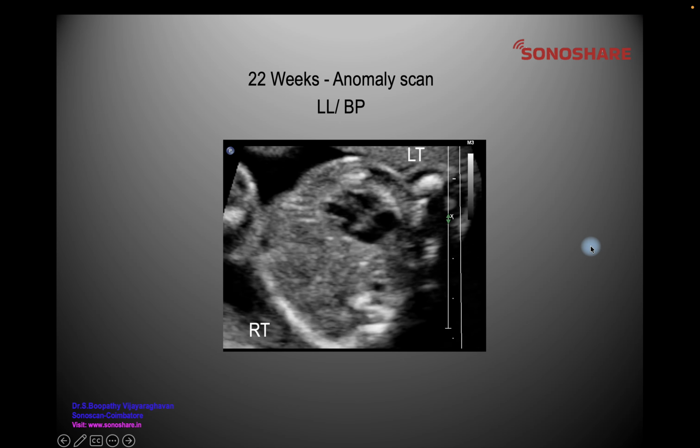This is next in the series of image to diagnosis in fetal medicine, first in the series of fetal thorax. This is a 22-week fetus coming for anomaly scan. Fetus is in longitudinal lie, breech presentation, and this is the axial scan of the chest, the level of the four-chamber view of the heart, and the fetal side is marked there. Fetus shows a mediastinal shift to the left.